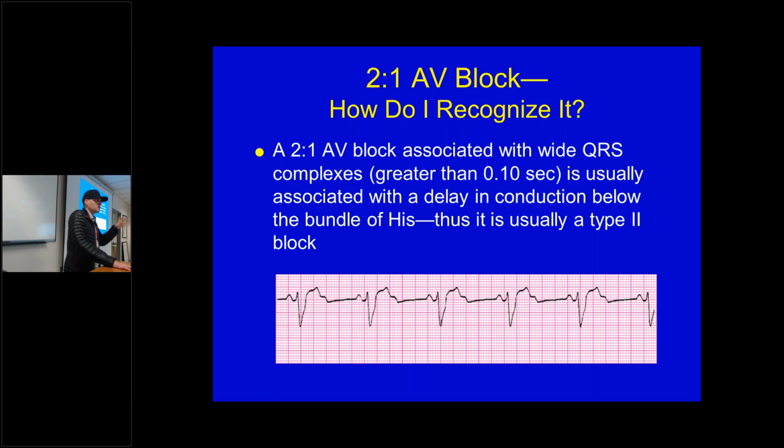That's why you're going to have that huge deflection on the S-wave. You don't really need to know why that is until we talk about full 12 lead EKGs and you start looking at which lead you're studying and why the QRS complex looks different in that lead.